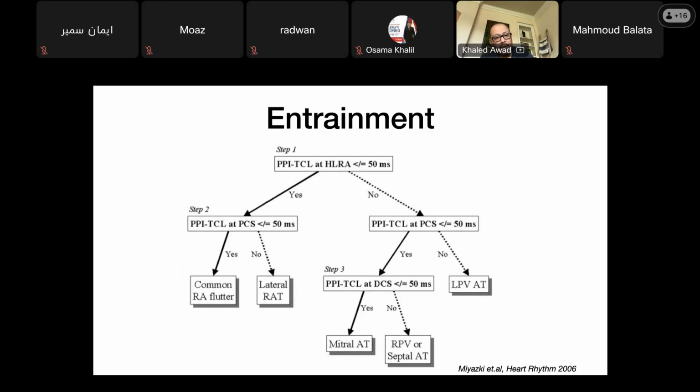If the lateral RA is in, but the coronary sinus is not in, well, guess what? Then we're localized to the lateral surface of the RA. This is somebody that has either an ASD, or right atrial pathology of some sort, COPD, right atrial scar, an incisional scar, or prior ablation involving the lateral RA. And we showed what that P wave would look like. Now, if the lateral RA is not in, then we move on to the next step, which would be the proximal coronary sinus.